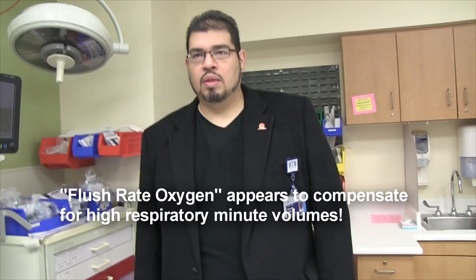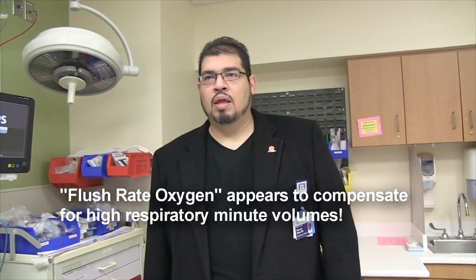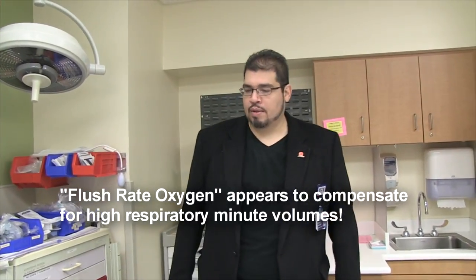I think what you just demonstrated with that mask was by cranking that up to 50, 60, whatever it is there, you didn't overwhelm the amount of oxygen that was coming in. Yeah, so again, if the patient is hypoxic, or they're air hungry, your supply of oxygen has to outweigh their demand. The liter flow that you deliver through this has to outweigh their minute volume. Yeah. Okay.